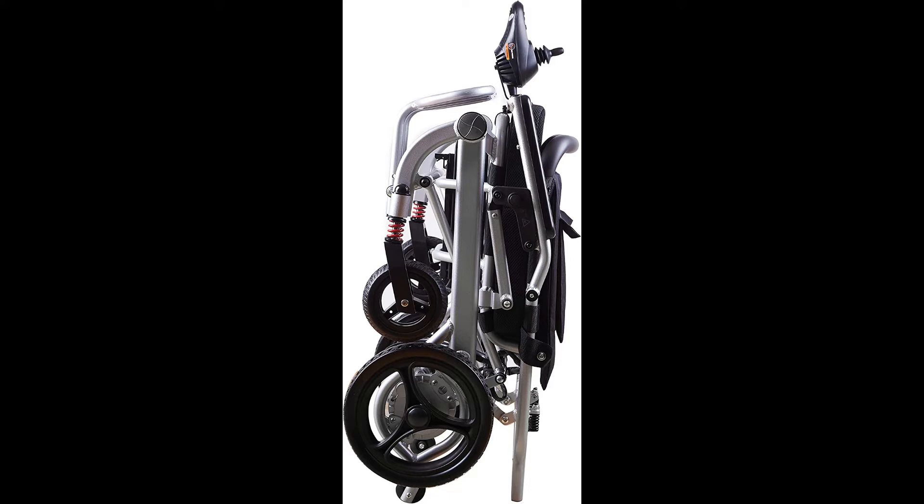One-second folding and fast folding mean it can be easily placed in the trunk of various vehicles, and can be dragged like a suitcase in the folded state.